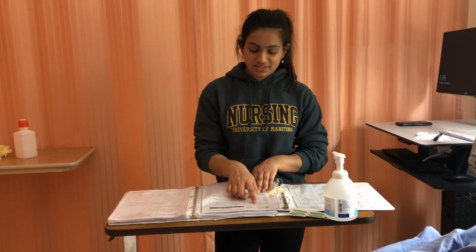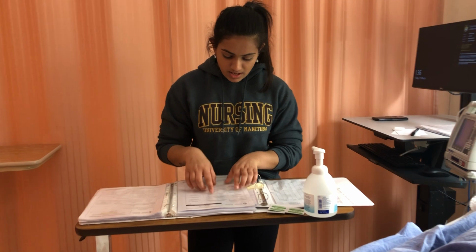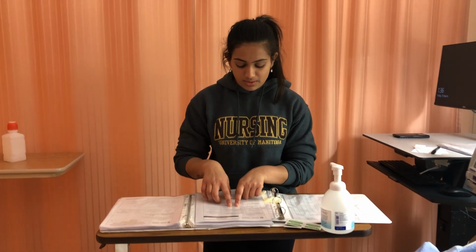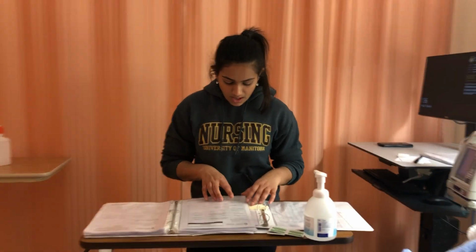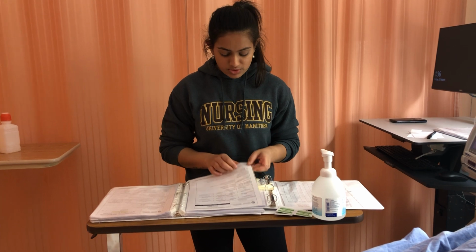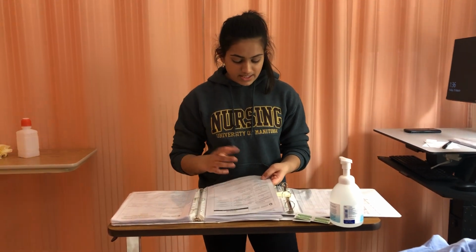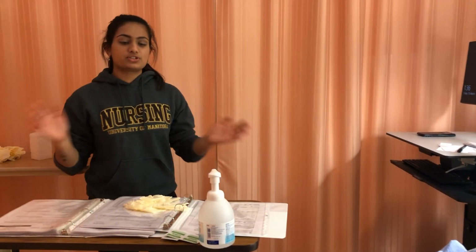Alright, just look at the IV continuous colleague guardian pump. So 25,000 premixed for a venous thromboembolism. It's 250 ml for the diluent, and we get a final volume of 250, final concentration of 100 units per ml. It's compatible with the normal saline, which is the bag that's running right now. Some potential hazards are bleeding and thrombocytopenia, which I will notify the patient of, and obtain baseline aPTT and CBC, which we already have done. So now I'm going to be entering the patient's room.